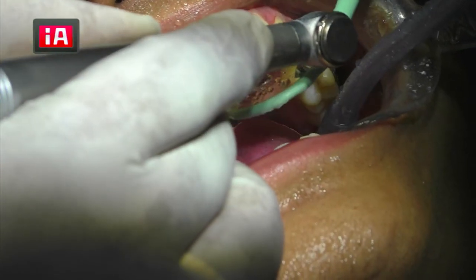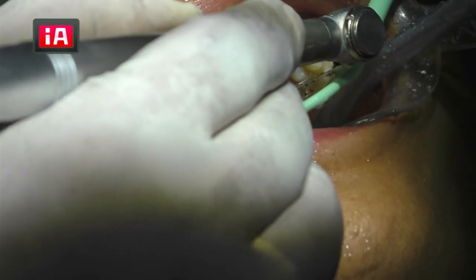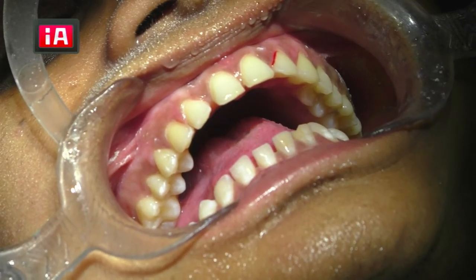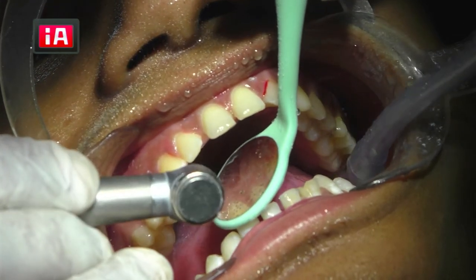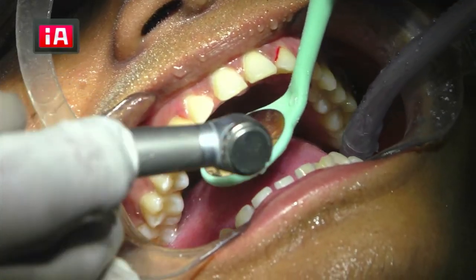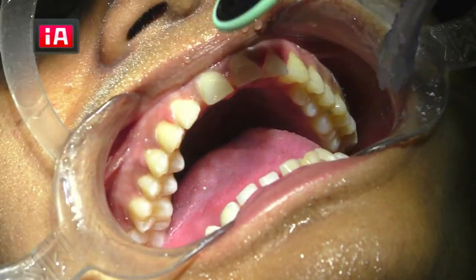I'll increase the depth later. First, I should get an idea of where my preparation should be. I'll take a little other bur. Slightly pronounce the margin. Okay, because if you don't pronounce the margins properly, the lab person won't understand where to end the veneer. They should be able to understand where exactly to end the veneer on the lingual.